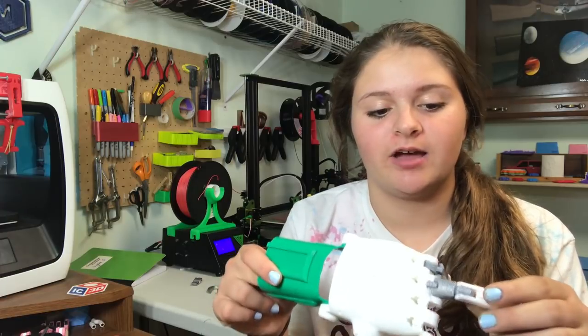Hey guys, it's Lydia here from LA 3D Printing, and today I'm going to be showing you guys step-by-step how I make these prosthetic bionic hands. Let's get started.